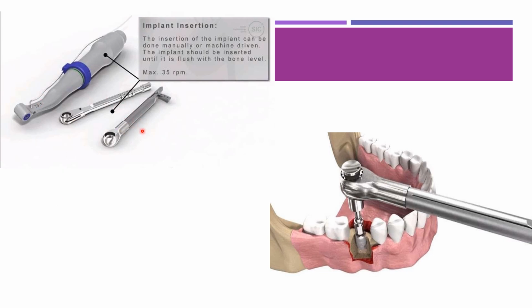Insertion of the implant must follow the same path or line as the osteotomy site. You can see that the outer non-sterile covering should be opened by the assistant without touching the inner sterile vial, which contains the implant and the implant screw. You can see that it will be carried to the site by the hand ratchet. So here is the hand ratchet. It will be attached to the hex drive, taken with the implant, and carried to the site by the ratchet.